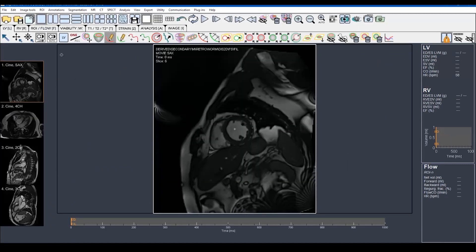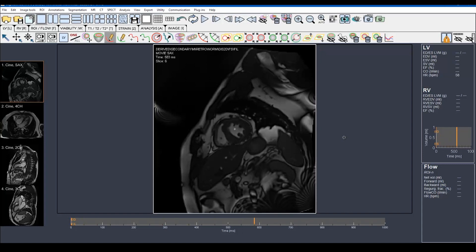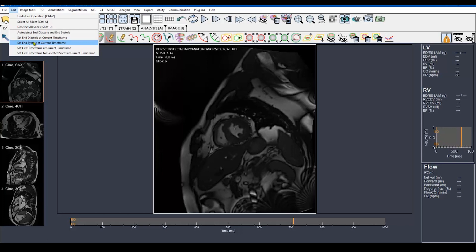These are the selected slices on the left panel. I'm going to start with the short axis. The first step, which is a very important step, is to set the end systolic phase, because the software by default puts both the end diastole and the end systole in the initial time frame. To do so, you have to scroll forward with your keyboard until you visually get the best end systolic phase, which is right here, and then go to Edit and set end systole at current time frame.